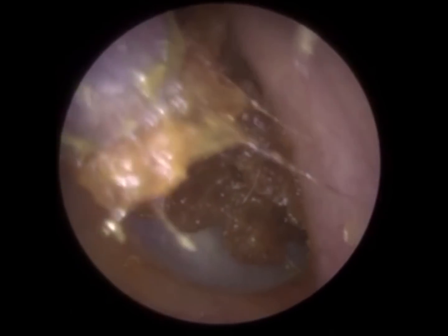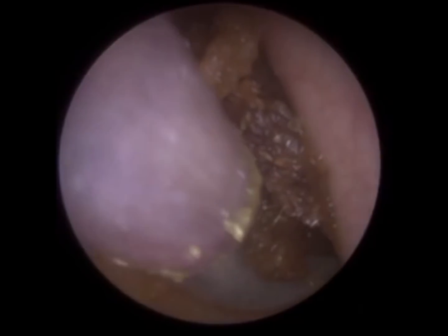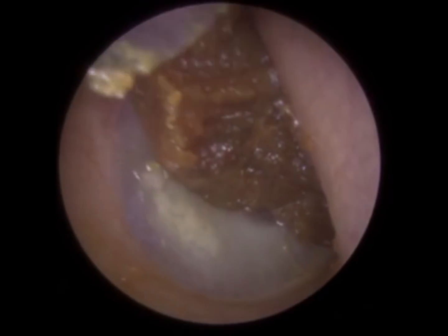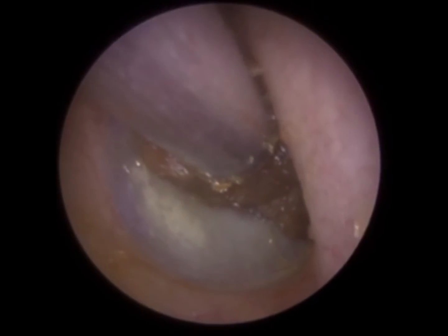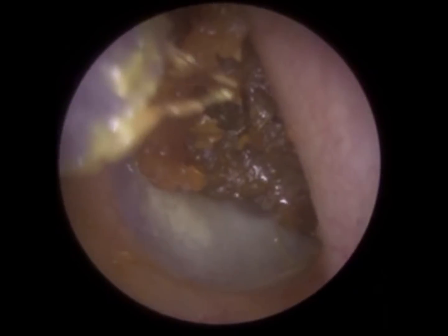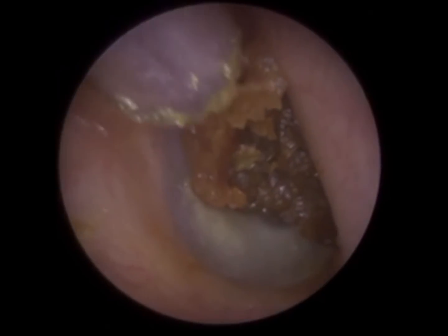And I think when you remove wax, it's so important to be able to visualize the entire ear. So we know which parts to manipulate, where the ear canal exactly is, so we don't come in contact. And with an endoscope, you really do feel like you're inside, well, at least I do. I feel like I'm inside the ear and I'm looking all the way around me.